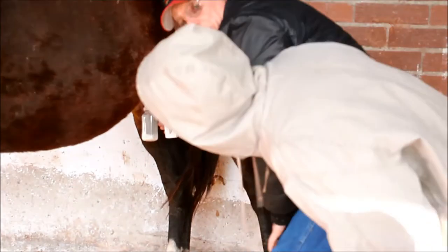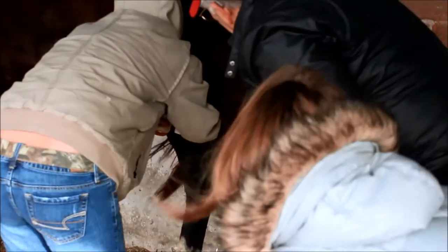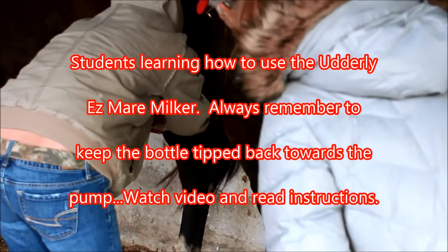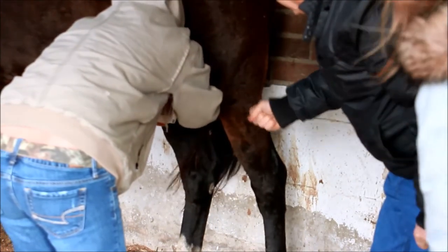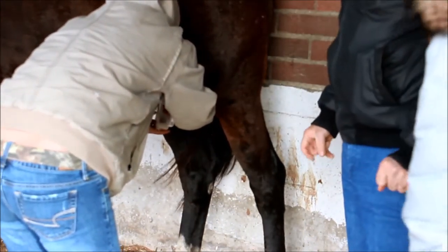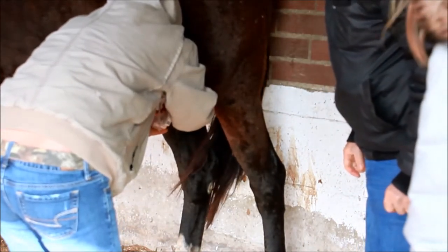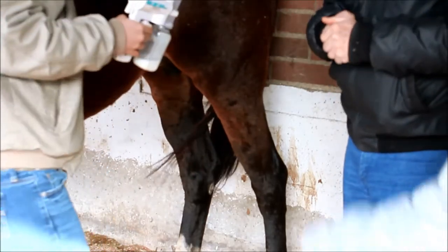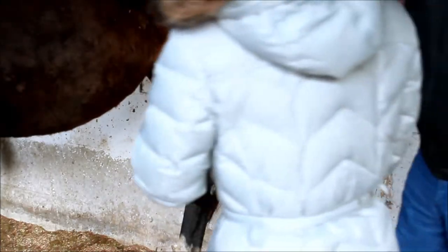Okay, you see it? Alright. I want you to try it. You've got to lock — push it up there. You've got to lock onto that. Pump her some more. Then you can go ahead and push it up into the bag a little bit, let her down, and then you've got two things working for you — the vacuum and also the gravity. There you go. Then you want to go over on the other side and try it. Anybody else want to try it? Try it. Put it on the other side? Well, try this side. You can reach over there and get that too.